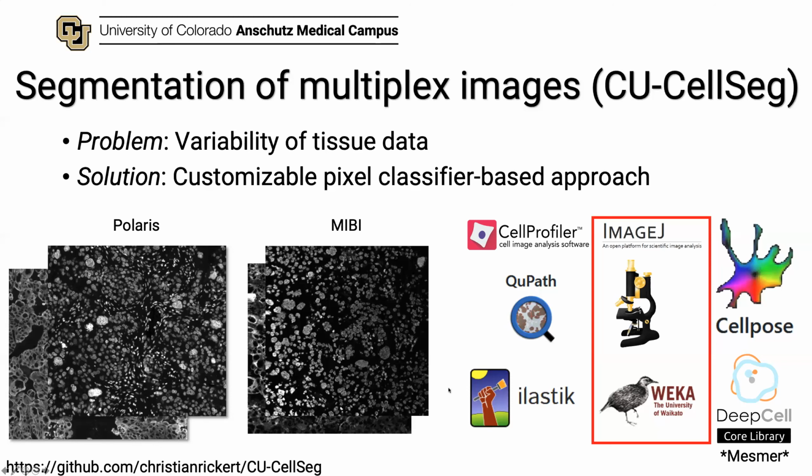So compared to Inform, this is open source, so we can feed our Polaris data into this platform. We can feed any other images that have been generated on any platform into this system, which is really nice.